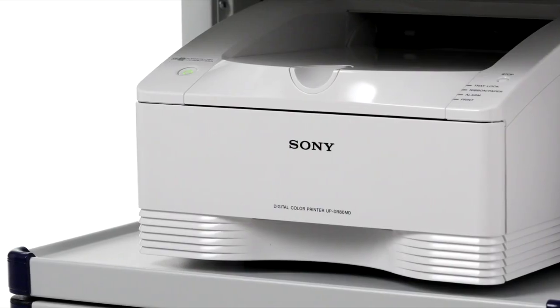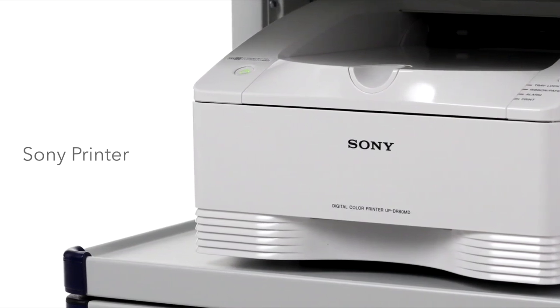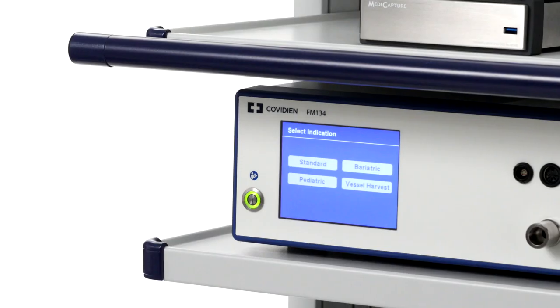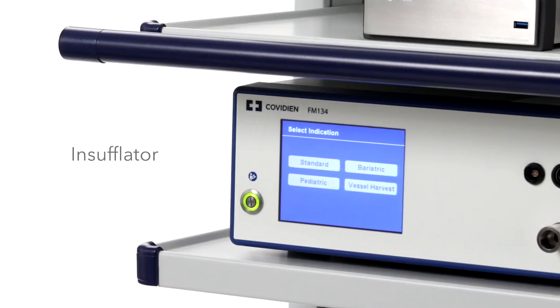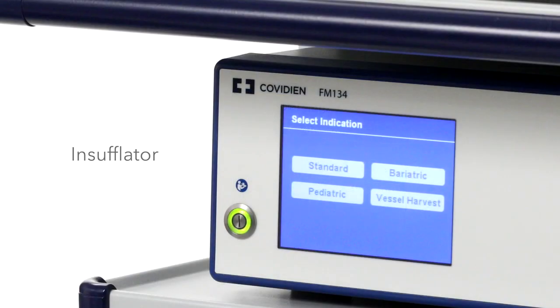The Sony printer is another component in the platform. It was designed to be integrated into medical imaging systems and produce hard copy prints of still images that are captured. The Elevision platform connects to a 50-liter gas heating insufflator with 4 specialty presets that include standard, pediatric, bariatric, and vessel harvest operating modes.